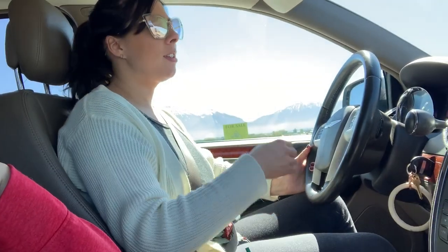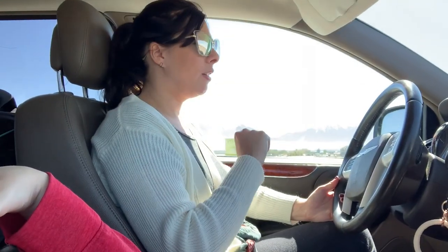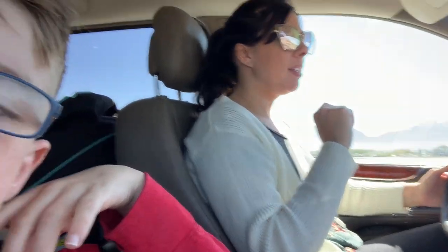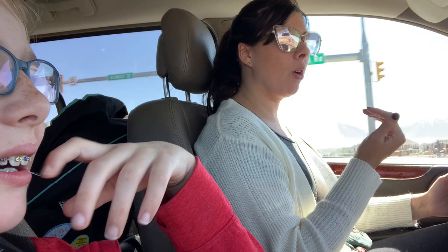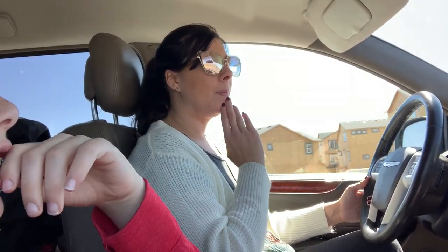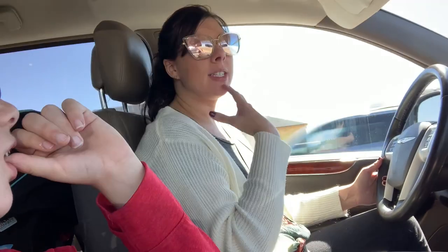So while I was getting my braces on, we got to watch some movies — first Moana, and then Cam got to pick and he picked Turning Red. They put both top and bottom braces on for Xander. Xander is going to have two phases of braces. Phase one is going to help his overbite and bring his bottom jaw forward.